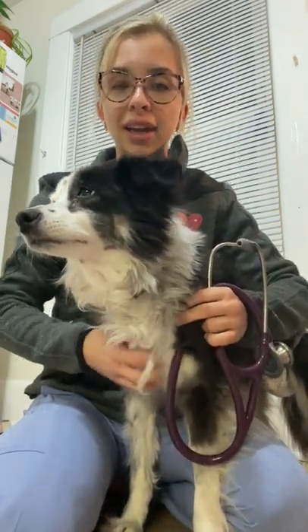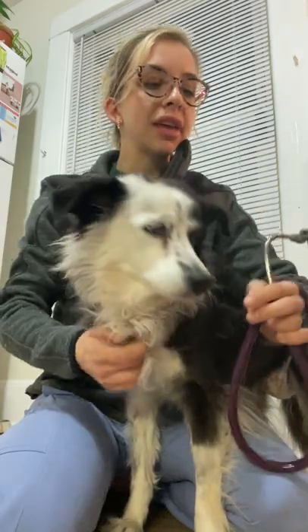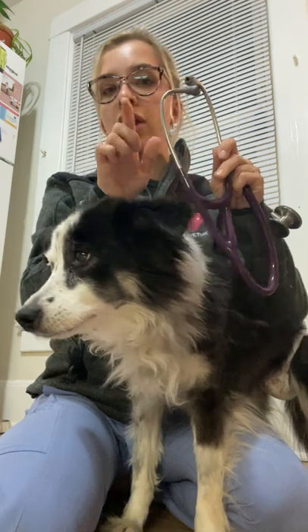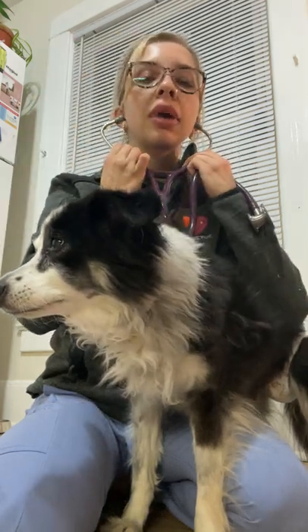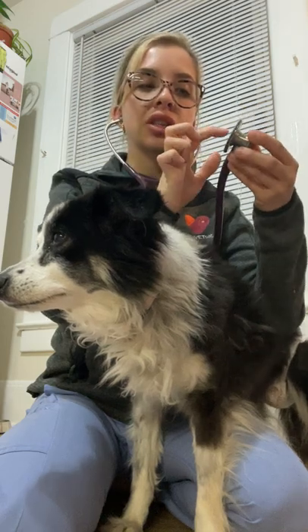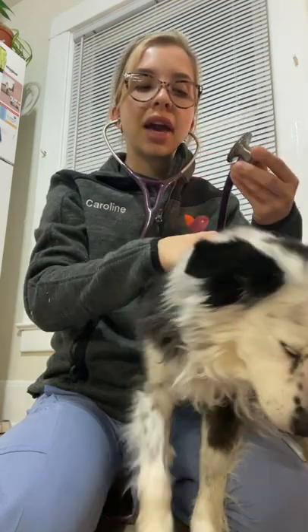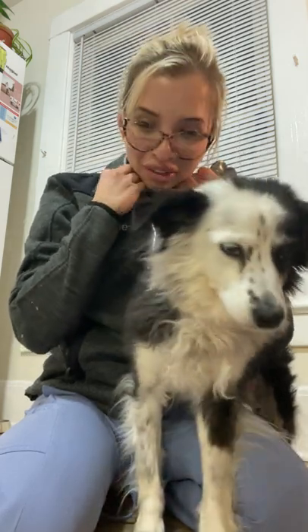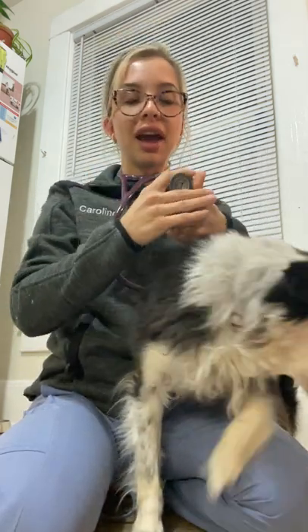For this SOP I'm going to be doing the cardiac auscultation on a canine patient. Taking my stethoscope I'm going to go ahead and place it in my ears with the angle of the earpiece facing away from me. A good way to check and make sure that this is on appropriately is just to gently tap and I could hear everything great. For the sake of this video I'm going to place this around my neck.